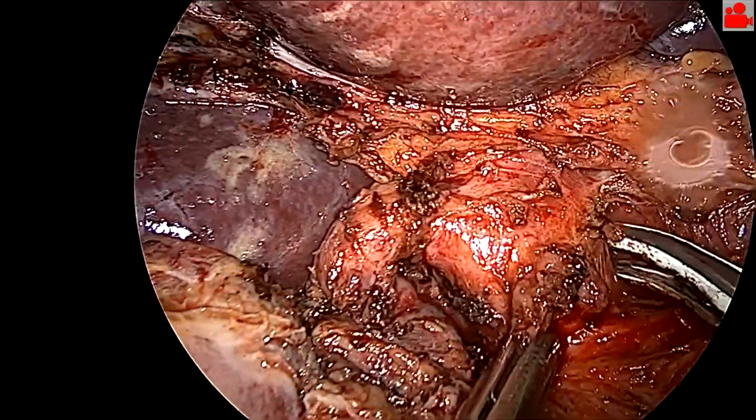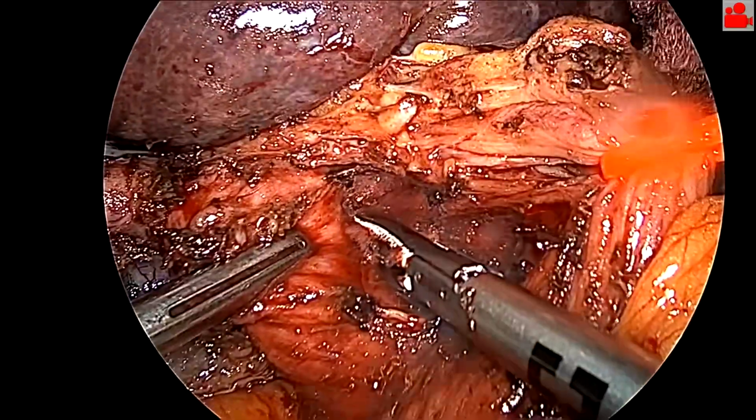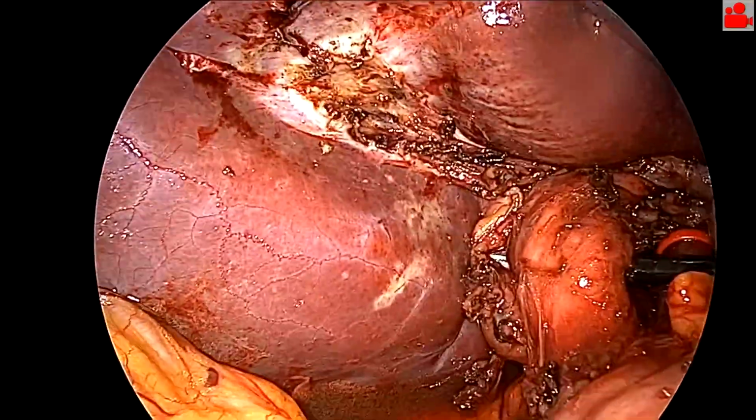In a similar manner, we proceed to mobilize the CBD, and here we can notice the identification of the critical anatomical structures in the procedure, and also we can already notice the significant dilation of the CBD.